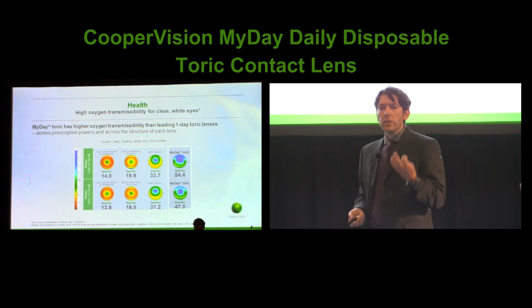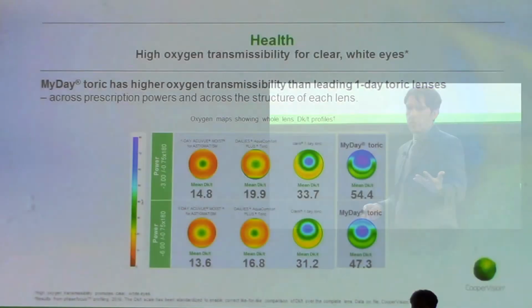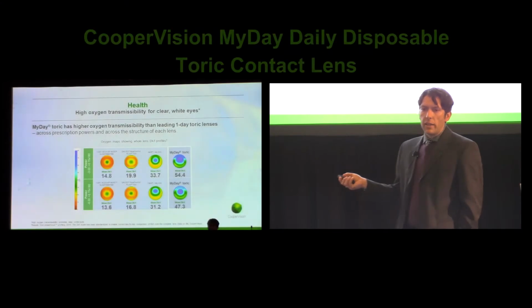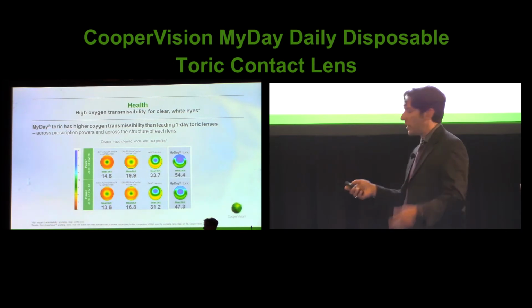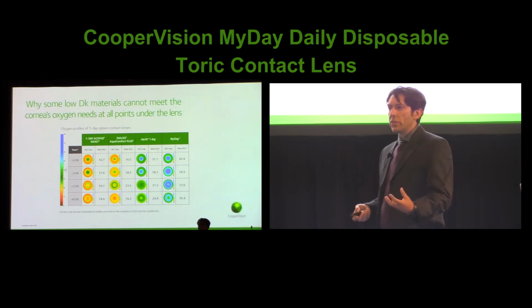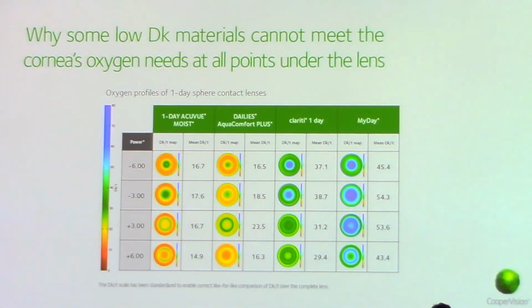And it becomes really clear the imperative we have to not only fit new contact lens wearers in the healthiest material, which you're already doing quite well, but to move over some of these existing wearers that are languishing in hydrogel materials. Now of course Joe talked about it. This is very dramatic in toric contact lens designs, because you have to have these thick stabilization features which can make the lens very thick. But actually, even in spherical contact lenses, hydrogel materials cannot satisfy even this lowest DK over T requirement across the lens of any single power and across the power range.